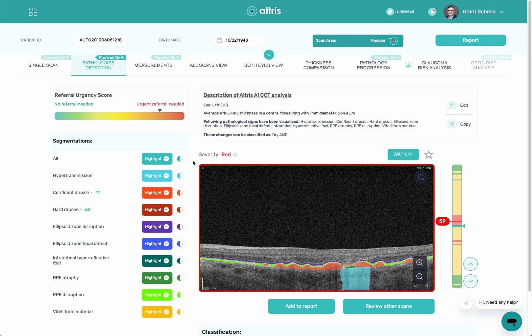There are a lot of AIs out there. A lot of the newer AIs are autonomous. The autonomous AIs using the US FDA system are designed to replace physicians — their goal is to identify if you have pathology or not. One of the downsides is that they're only looking for one pathology, such as diabetic retinopathy. The AI will identify yes or no to that, but it'll ignore AMD or glaucoma or other pathologies because it's only allowed to look for that one pathology. We've taken a different approach for a different audience, showing you as much information as possible and allowing you to make that decision.